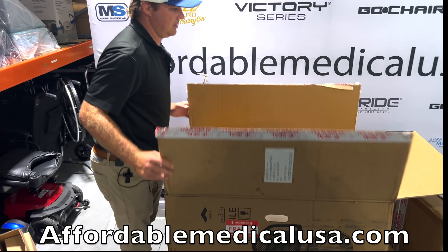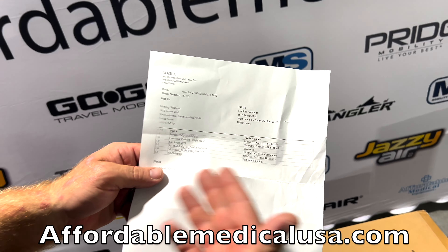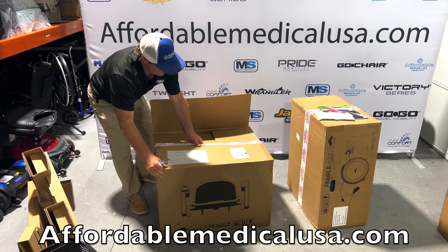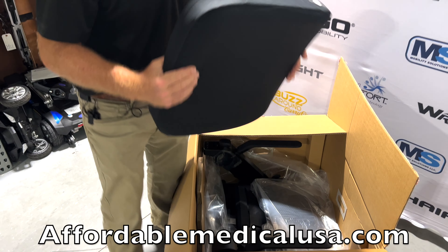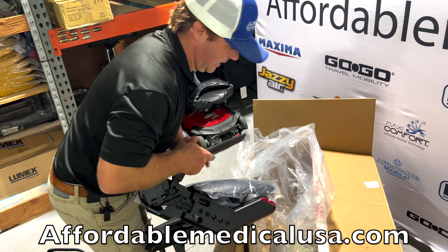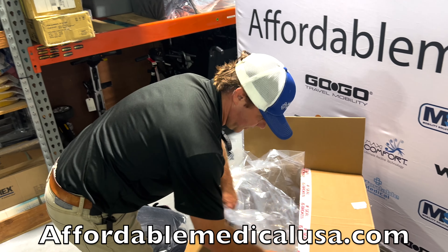That's pretty much everything out of this box. Here's a packaging slip — you definitely want to check this if you're missing a box and make sure you're getting everything that you ordered, as some things might be accessories. You'll have a seat cushion — it's a standard foam seat cushion with velcro, but you can put different seats in here. This one's in green, but if you get green and don't like it, you can always change these little panels to different colors. They offer a lot of different colors — I think up to six.